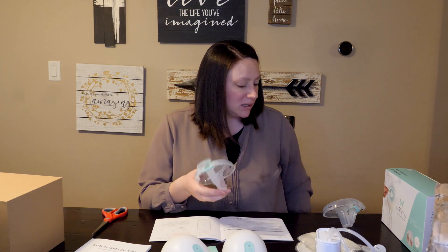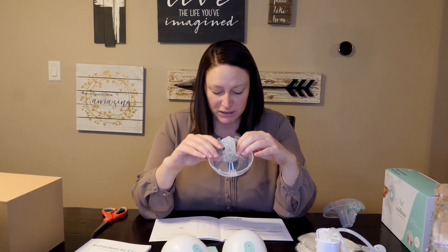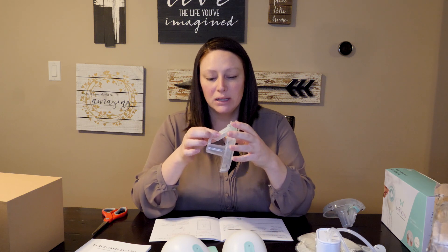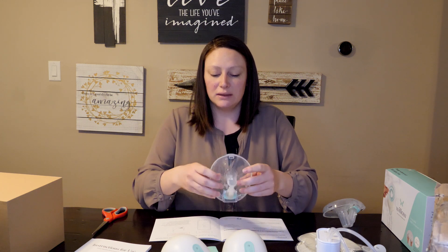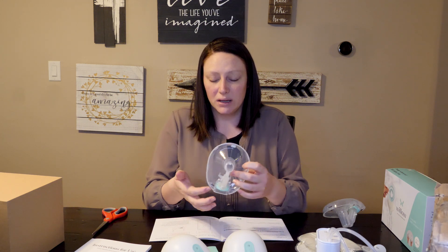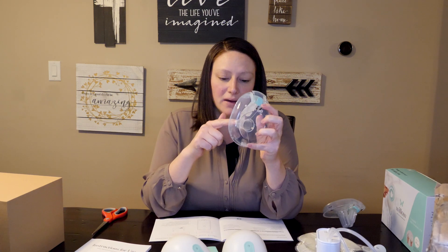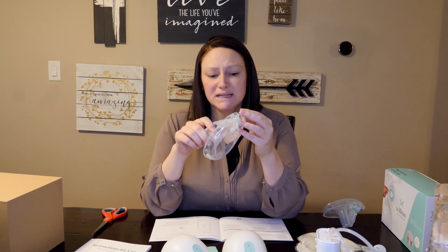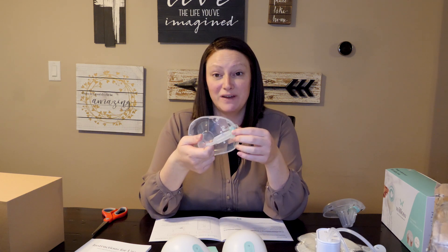The most tricky part I would say is the flip to finish. Because of this little container here and the flex tube, you have to turn it towards you and then tip it and it kind of gulps the milk. I still had a few drops — just a drop or two — so there wasn't a ton that was wasted. But it will take some practice to get that perfected.